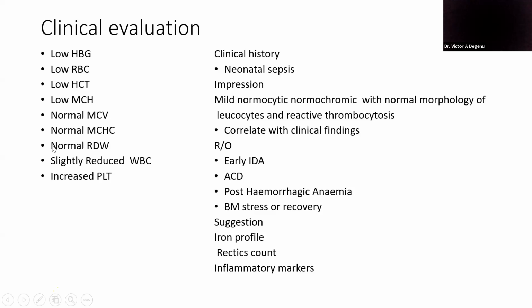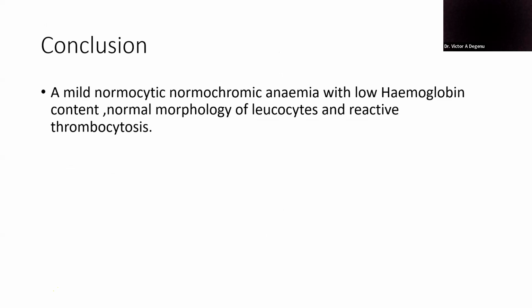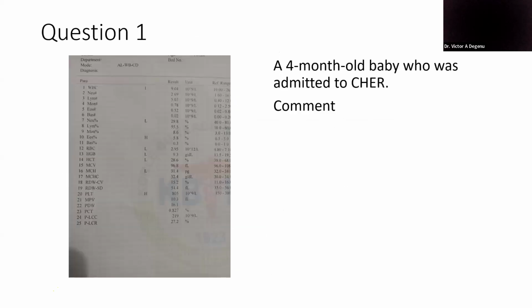So if you look at the clinical values, the WBC is slightly reduced. It's not total reduction. If you look at the WBC here, it's 9.04, for which the reference range is 10 to 26.